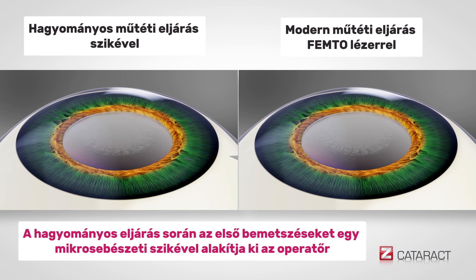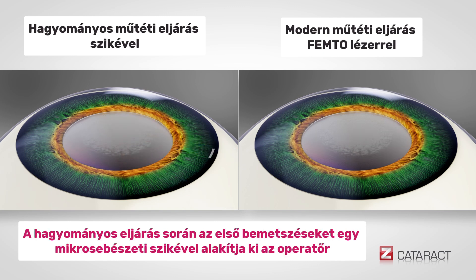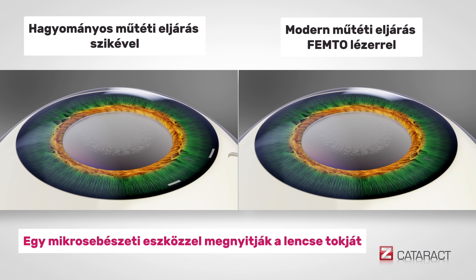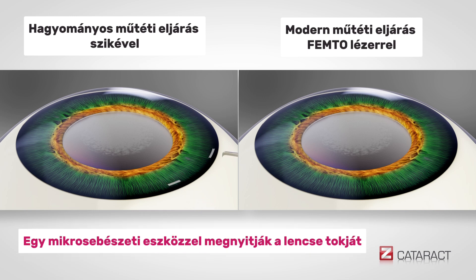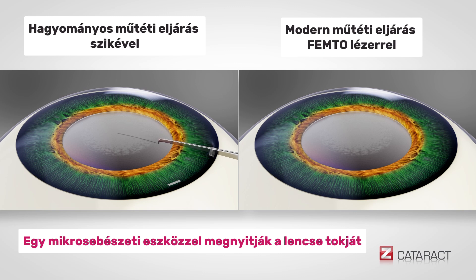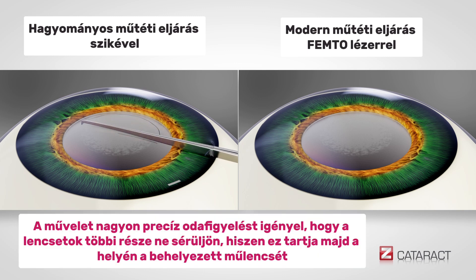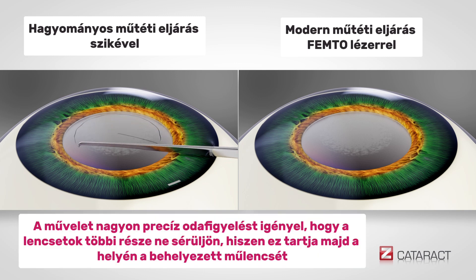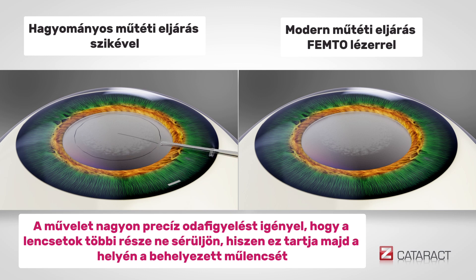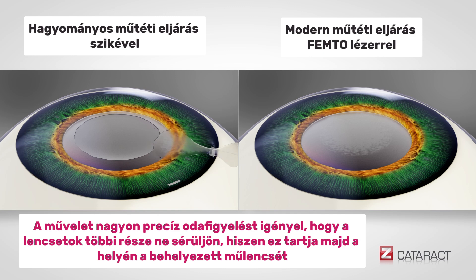In traditional cataract surgery, incisions into the eye are manually created with a blade. A microsurgical instrument is used to cut an opening in the lens capsule. This opening needs to be made very delicately without damaging the rest of the lens capsule, as this is needed to hold the new artificial lens in place.